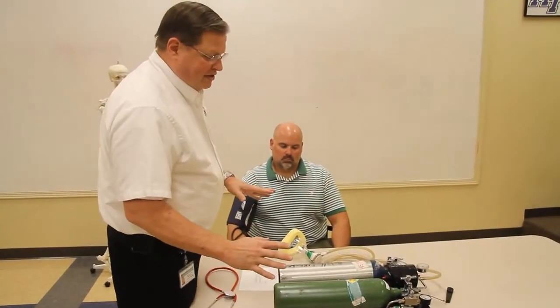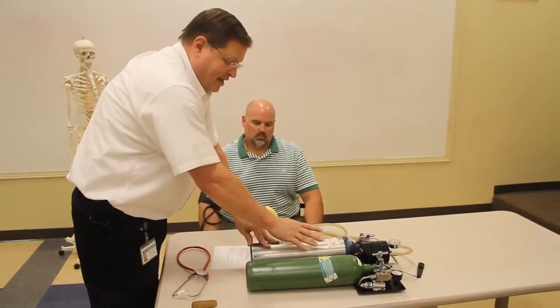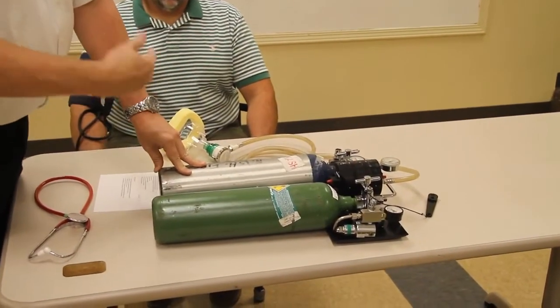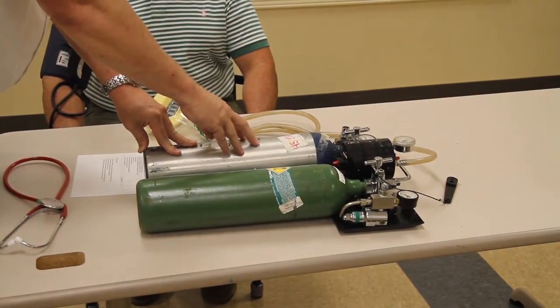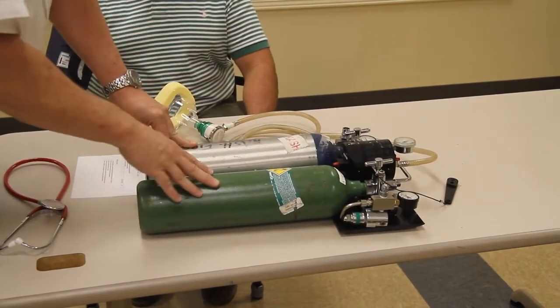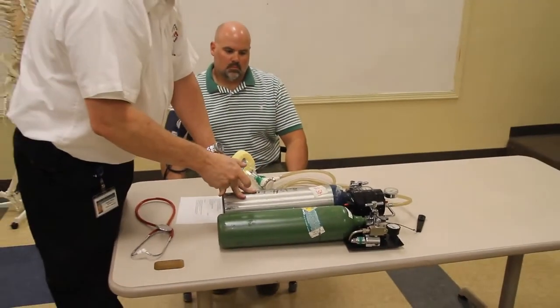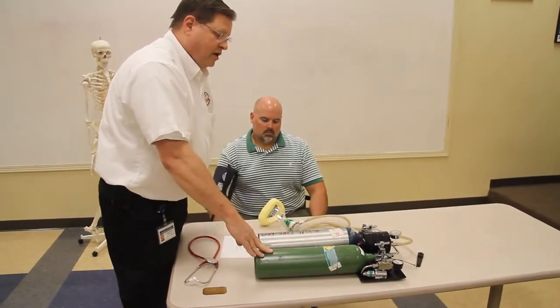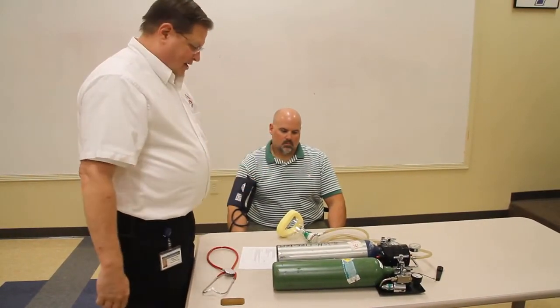The next thing that we want to do is prepare the equipment. In this particular version, we have an oxygen tank and a nitrous tank, and we have a mixer right here. In the newer versions of this apparatus, there is just one tank, and it is a 50% oxygen, 50% nitrous mixture altogether. There's also something missing from this, and that is a scavenger unit. The scavenger unit basically pulls back in the exhaled air and filters it back out, so you're not breathing nitrous oxide inside a confined space like an ambulance.